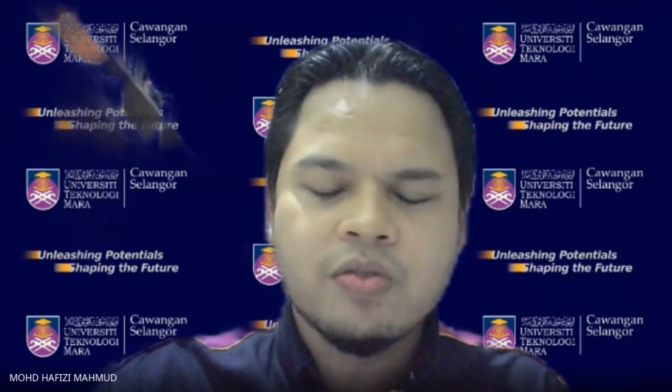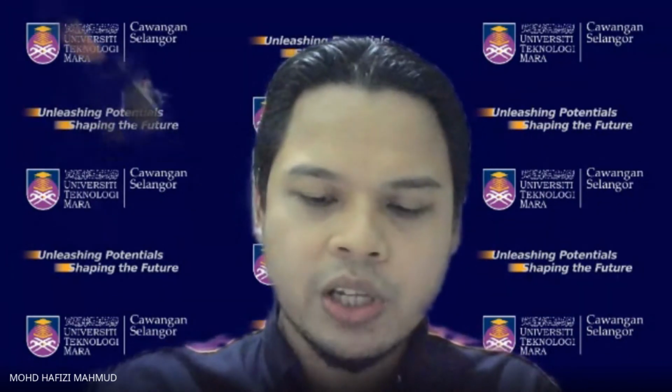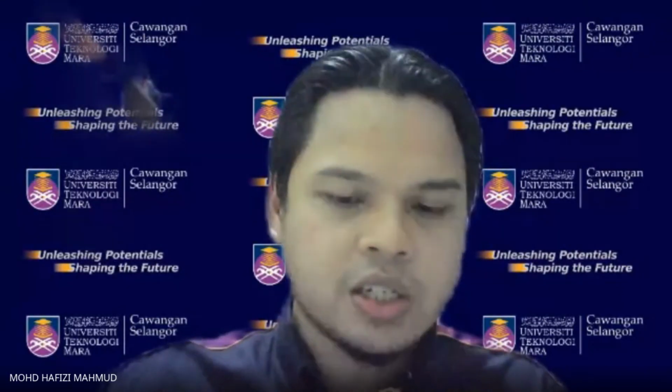And also for cardiac imaging, if not mistaken, they use dual energy CT, but it depends on the requirement. It's not a routine examination, but is based on the request by the clinician for further analysis, for further diagnosis of the disease. Okay, and the second one is about the importance, right?